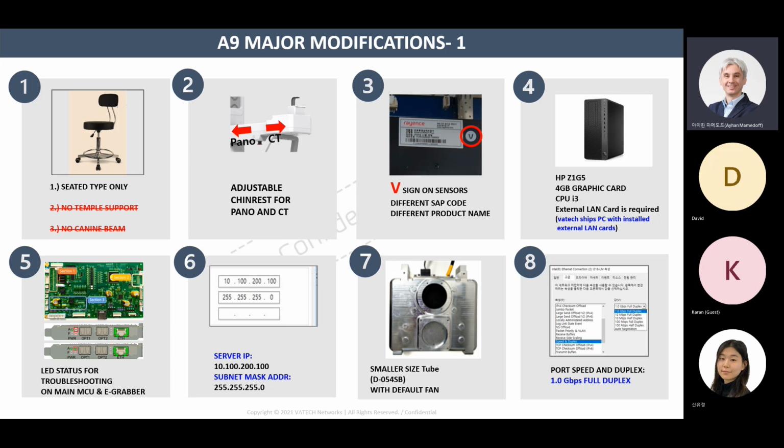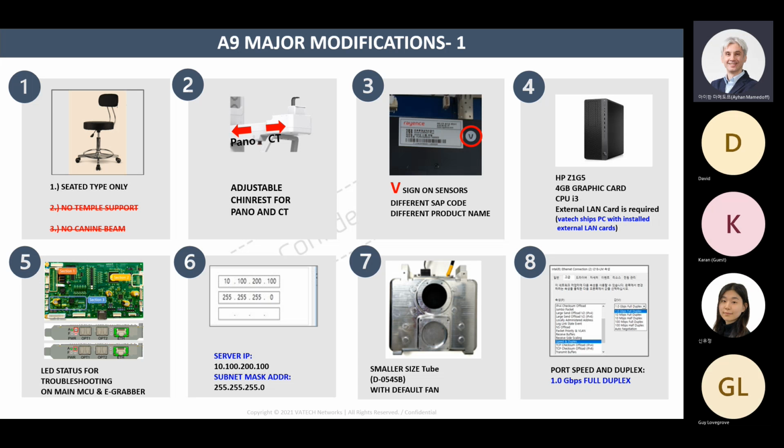I will later show you in more detail. Every lamp on these 3 sections will have a specific number code, and it will have an explanation. So just by looking at the lamp, you'll be able to understand at least where the problem is, and you will save your time by finding the problem parts.